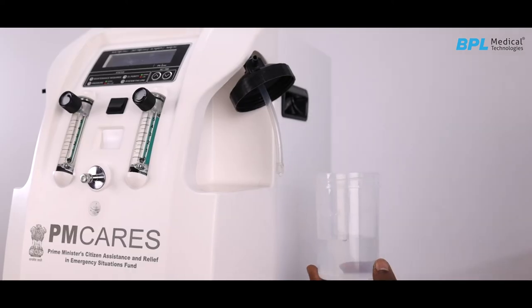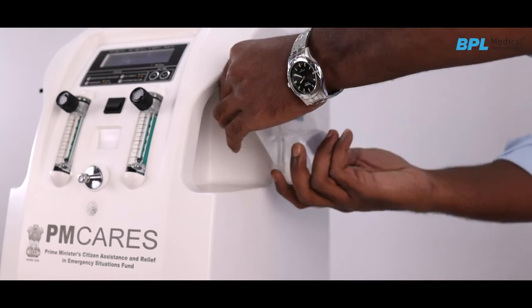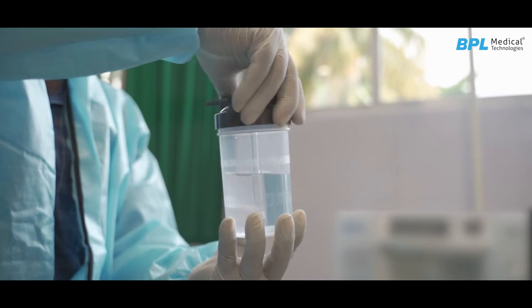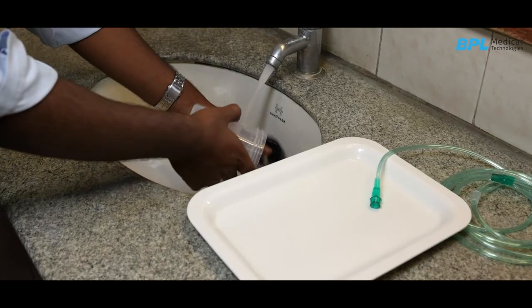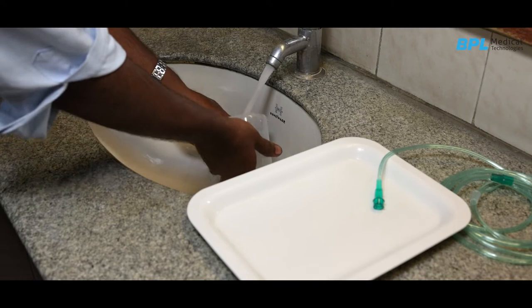Take out the humidifier bottles and fill with distilled water. If distilled water is not available, use RO water. Users should always monitor the water level in the humidifier. Water in the humidifier needs to be changed every day. Before refilling, clean the humidifier with liquid detergent and rinse thoroughly with warm water.